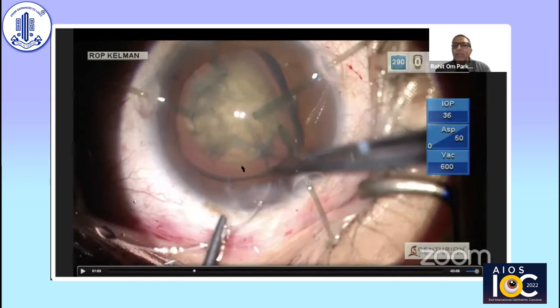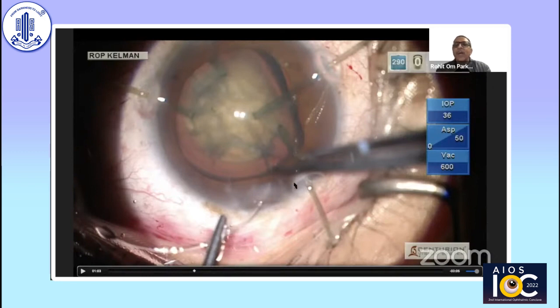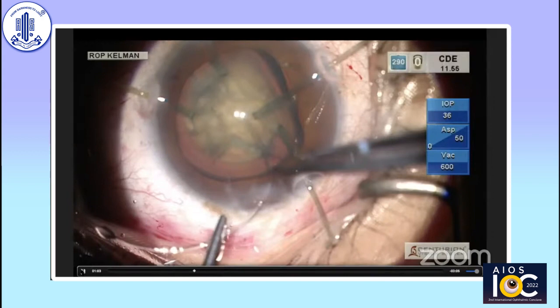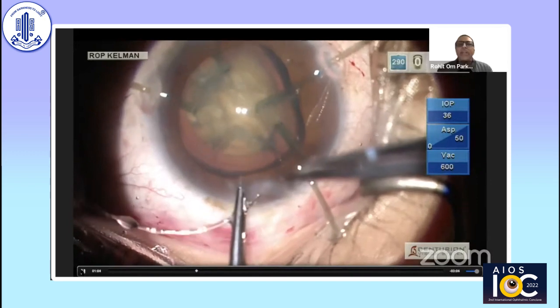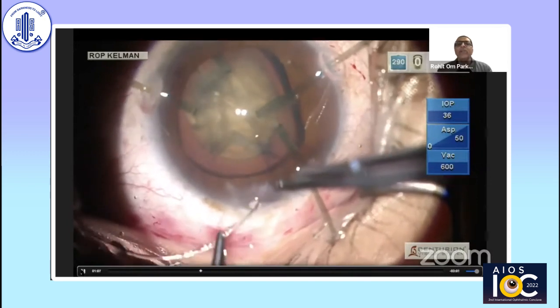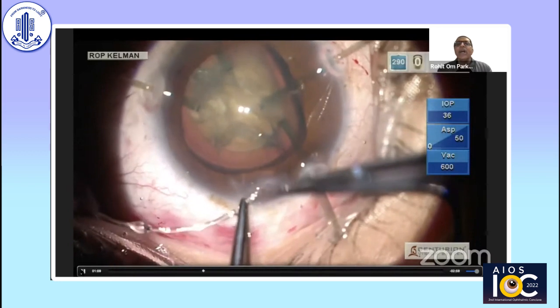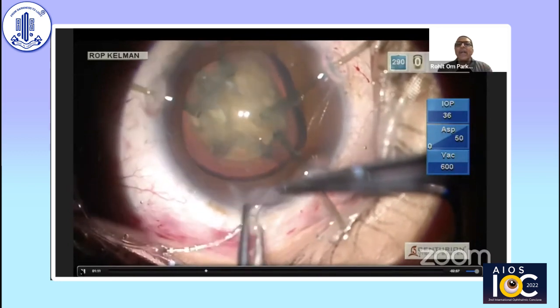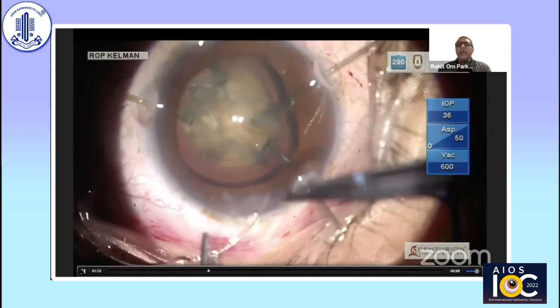I tried to do it, but I should have done it in a clockwise manner. Since the capsular hook was in the way, I started doing it anticlockwise instead, but I targeted the area where the zonules were intact. I was able to implant the CTR such that it anchored where the zonules were intact.